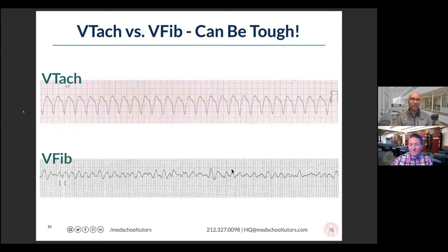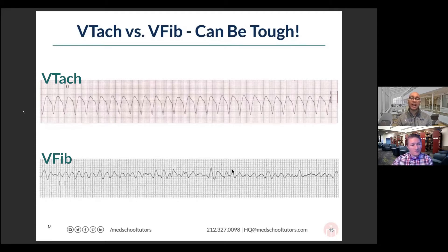It is difficult to tell the difference between ventricular tachycardia and ventricular fibrillation. Remember, both are wide complex tachycardias, or they can be wide complex tachycardias. VTac, at least in its monomorphic form, tends to be more regular. Ventricular fibrillation is more of this jumbled mess where there isn't a clear pattern to it.